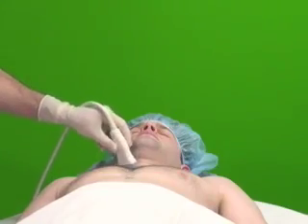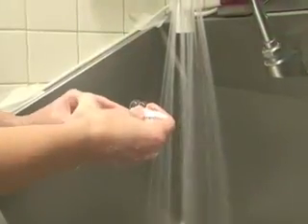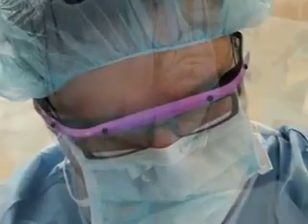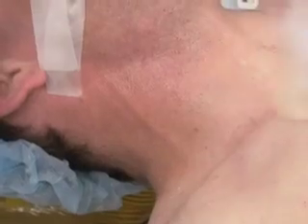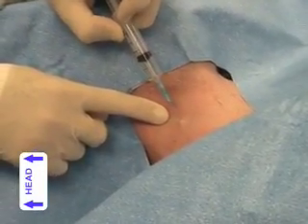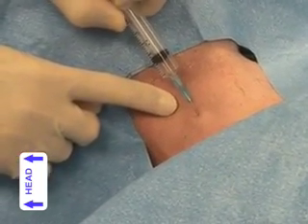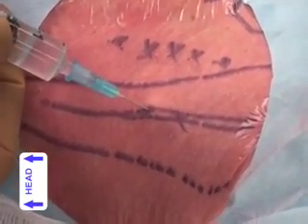Evaluate the potential placement site with ultrasound before establishing a sterile field, and confirm that the proposed vein is patent by ensuring it is compressible. Since performing central venous access carries the risk of infection, follow universal precautions when placing a central line. This includes hand washing, wearing a sterile gown, surgical cap, mask, eye protection, and gloves, and using a full-size sterile drape. Once the patient is positioned, prepare the skin using a chlorhexidine-based antiseptic and cover the area with a sterile fenestrated drape. If the patient is not receiving general anesthesia, anesthetize the insertion site with 1% or 2% lidocaine, taking great care to avoid intra-arterial injection, as even a small amount may precipitate central nervous system toxicity.